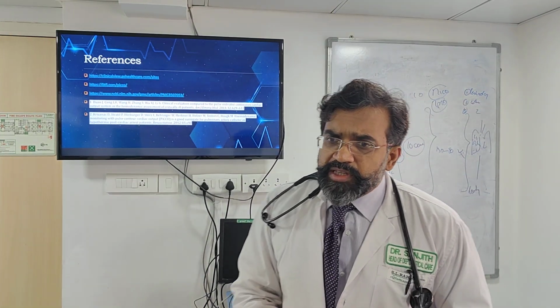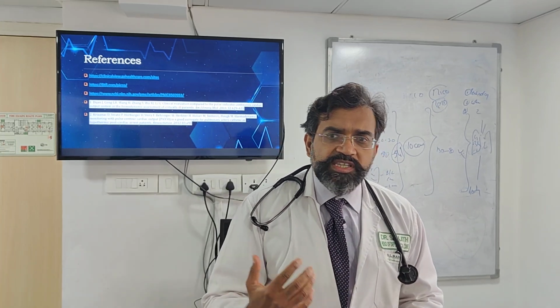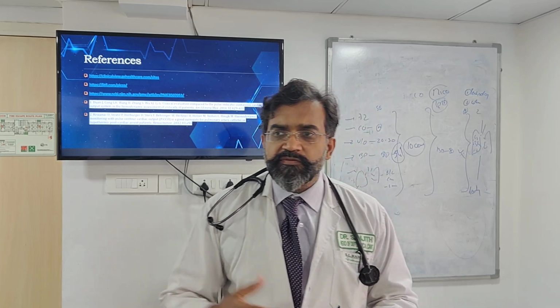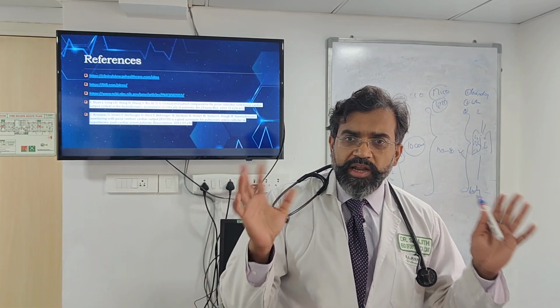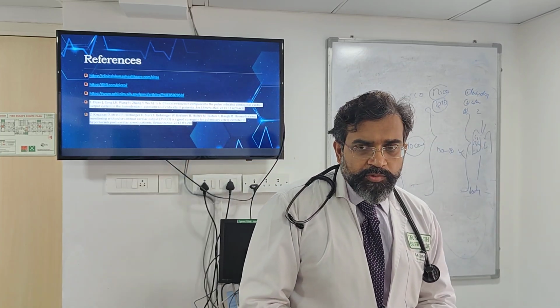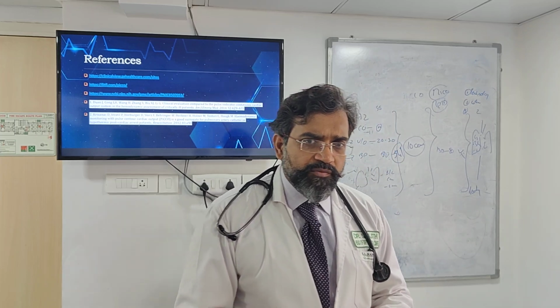Not only does it give me that there is pulmonary edema, it also attempts to tell me whether this is capillary leak or hydrostatic, whether it is because of my excess fluid or because my capillary is leaking, which will now tell me what is to be done, apart from various other things that it can give me. Then I will decide whether I give fluid or don't give fluid.